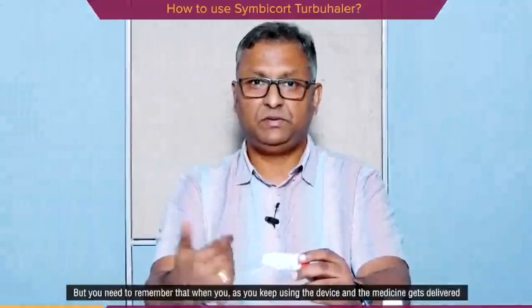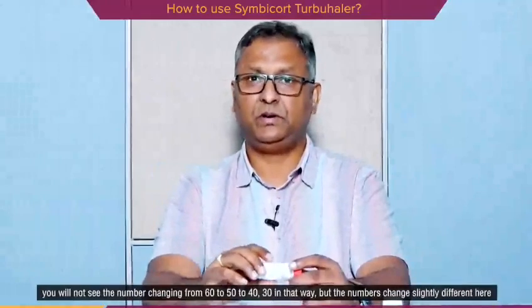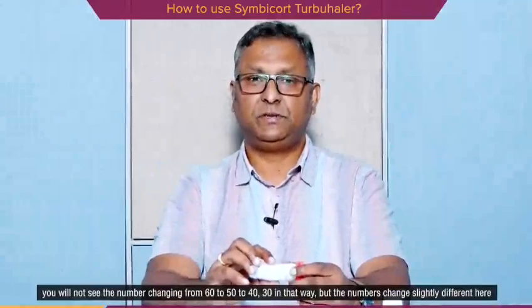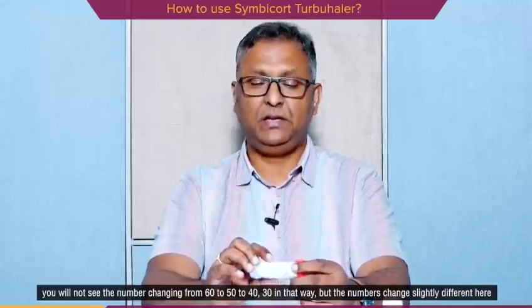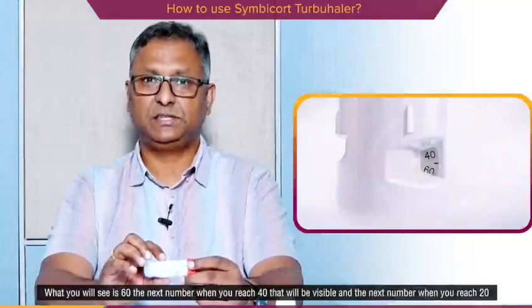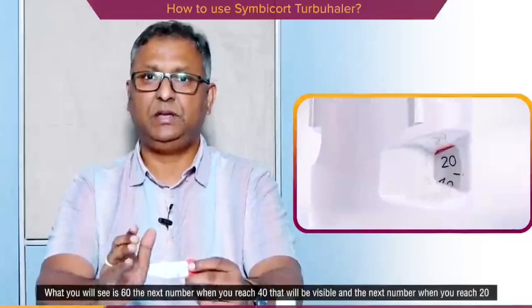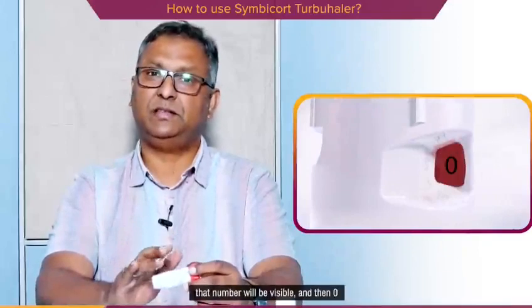But you need to remember that as you keep using the device and the medicine gets delivered, you will not see the number changing from 60 to 50 to 40, 30 in that way, but the numbers change slightly differently here. What you will see is 60, the next number when you reach 40, that will be visible, and the next number when you reach 20, that number will be visible, and then 0.